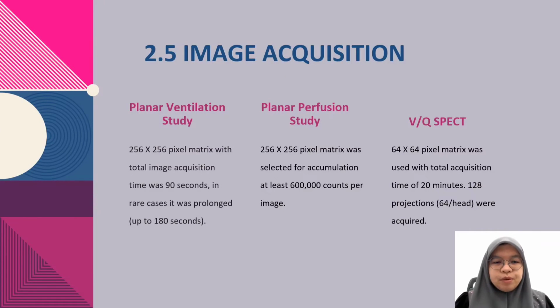For the planar ventilation study, the pixel size is a 256 by 256 pixel matrix with a total image acquisition time of 90 seconds. In rare cases, it was prolonged up to 180 seconds to get the image.